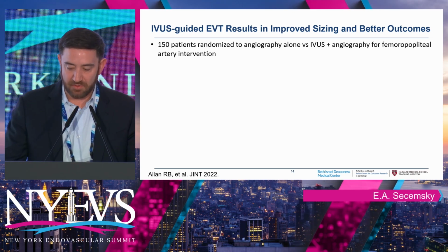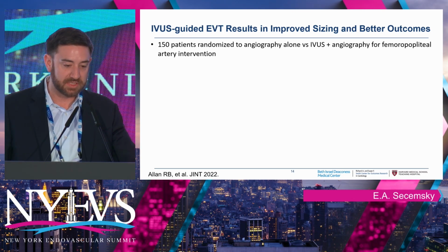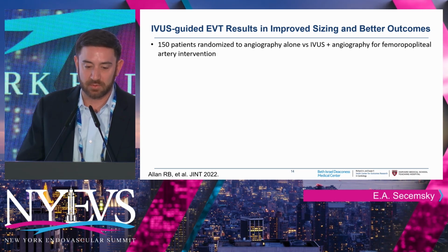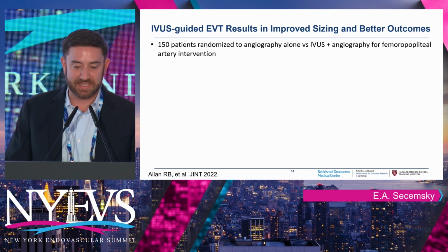Now, data here is evolving, and this has really helped us, again, with a lot of the concerns we've had with reimbursement issues and payers not wanting to cover our devices. These are the studies and programs that help protect our reimbursement. And so we have 2 randomized trials now. Again, this is now in the femoral popliteal space, not BTK.